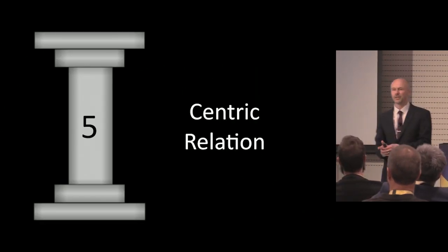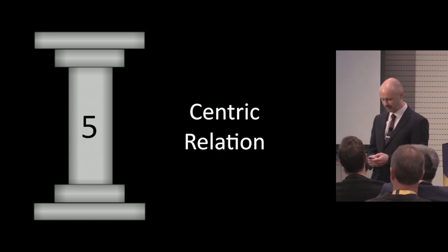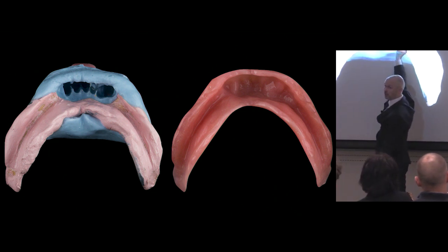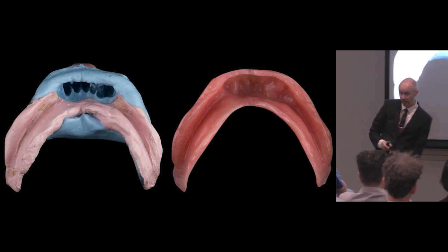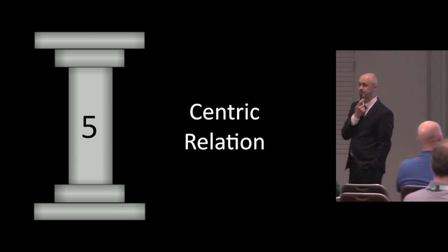Sorry, your question? Do you still use that two-tray approach when doing a partial? If I was doing a partial, I would do it as a one-er because there's just too much discrepancy between here and here to get a chrome or something like that fitted. So I'd do it in one. But I'll show you that in a minute, in part 2 of this. Okay, any questions about impressions, definitives, or?